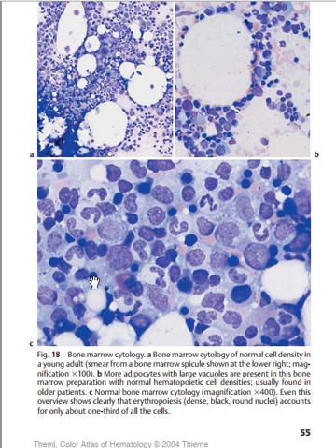So you can just go back to the last tutorial that we just did in order for you to identify the structures. The cell here is large in size. You can think that this is an erythroblast or a myeloblast. So this can be an erythroblast or a myeloblast. Is it clear? And this can also be a myeloblast. Is it clear? So you can visualize a different diagram based on their size and the color of their nucleus.